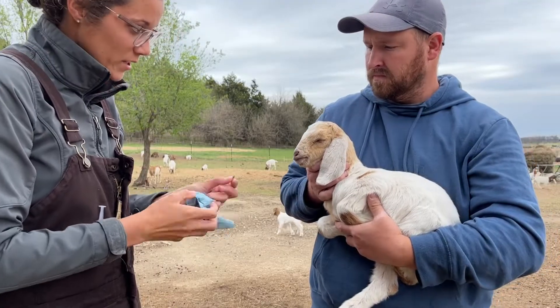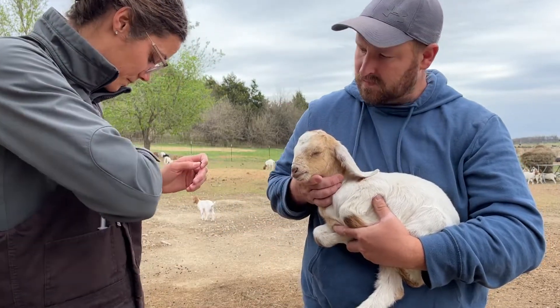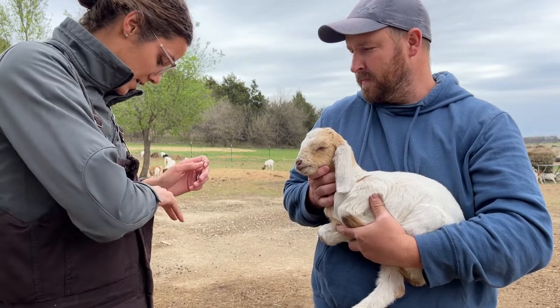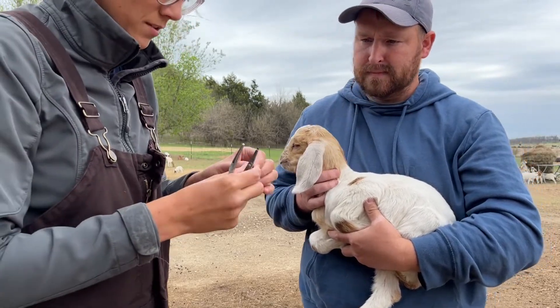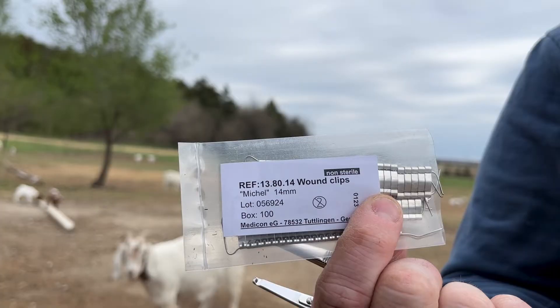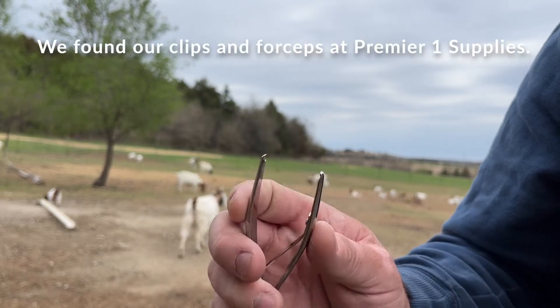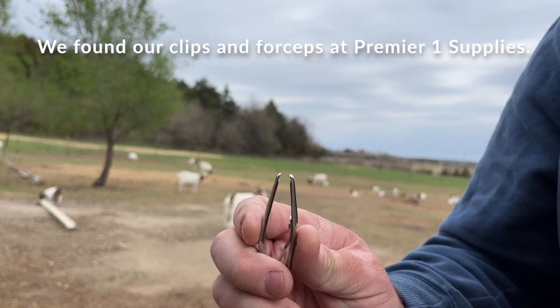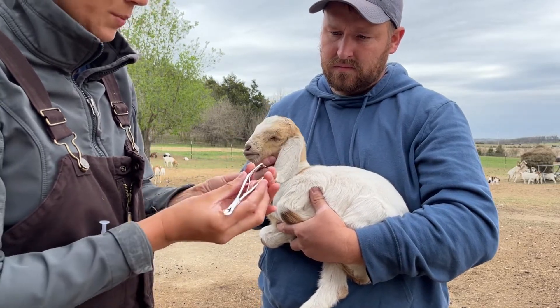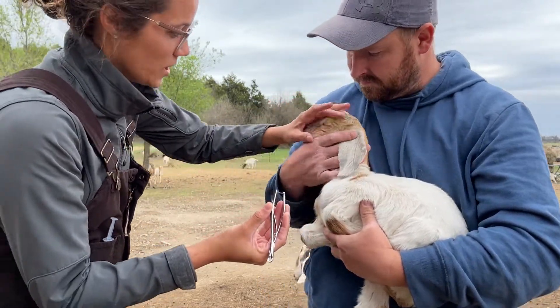The way we're going to fix it is to dry her eye off really well, clean it up, and then take these wound clips — these are 14 millimeter wound clips. There are little grooves in here that the little clip will sit in while you're applying it, and we're just going to pinch the bottom of her eye to roll that eyelid out. This helps keep a firm grip.